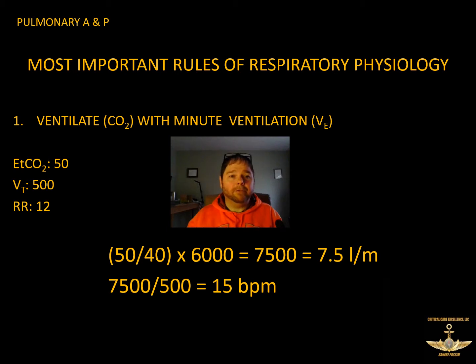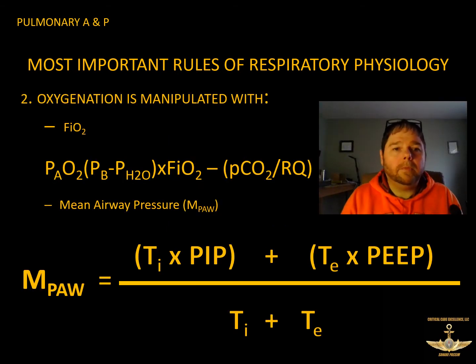So that takes us to the next rule, which is we oxygenate with mean airway pressure and FiO2. So FiO2 is going to be the simplest, easiest way to get this started.